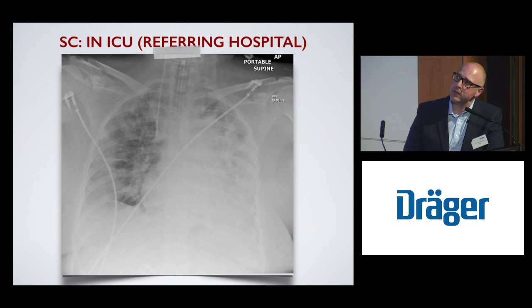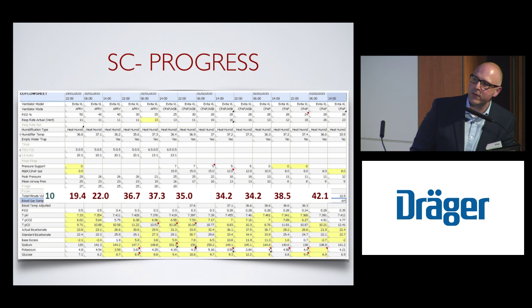So what do you think happens to that lady? The clue is in the title of the presentation. Obviously, she goes onto APRV, gets recruited on APRV, and you can see that in the next few hours. If you follow here, this is a screenshot of the electronic patient system, and you can see here the modality of ventilation, and here you've got the gases, and you can see we start at 80%. After a few hours, she's already on 50 and goes down.